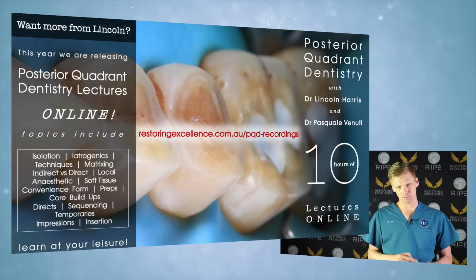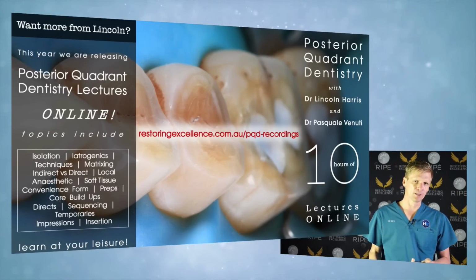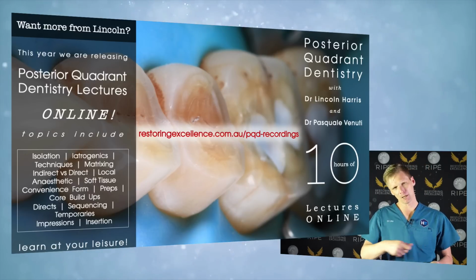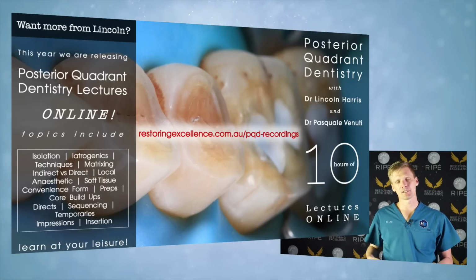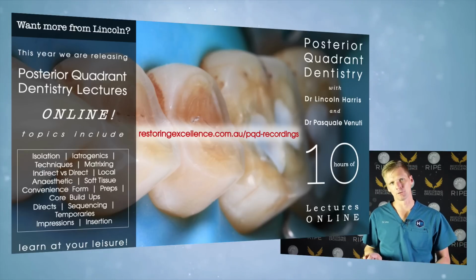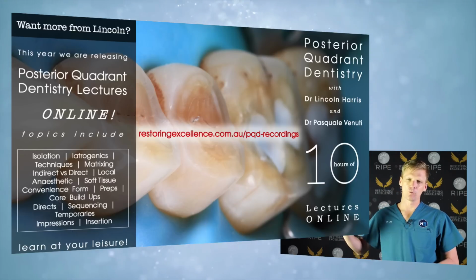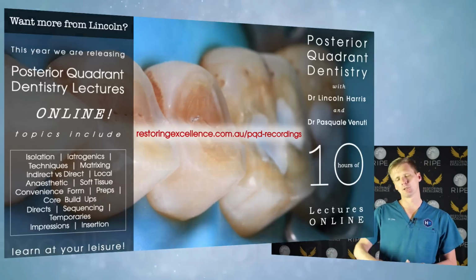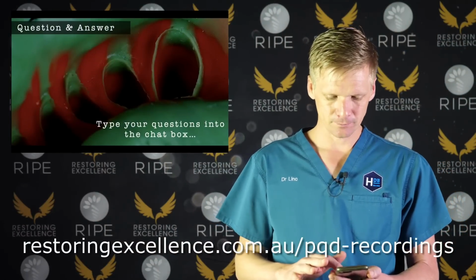I find that I get good bonding with the SE Bond, but generally with a core build-up, unless I'm worried about a pulp exposure, I'm going to use a slow burr, not the diamond burr, but a slow burr, and I'm going to remove anything that's not hard. So if it's black but it's hard, that's as much as I'm going to remove. If I'm over the pulp, then I might be a bit less aggressive, but otherwise if I'm far enough away from the pulp, I'm going to remove everything until it's hard for core build-ups.